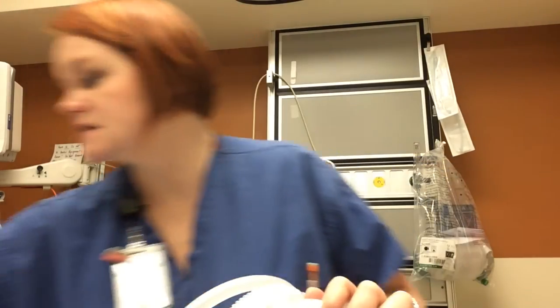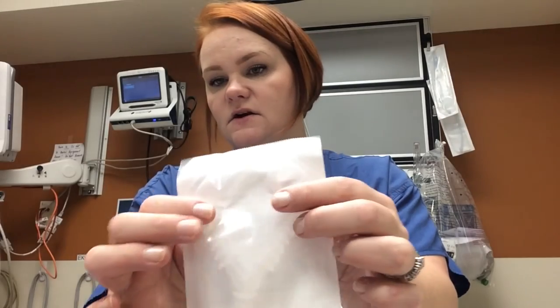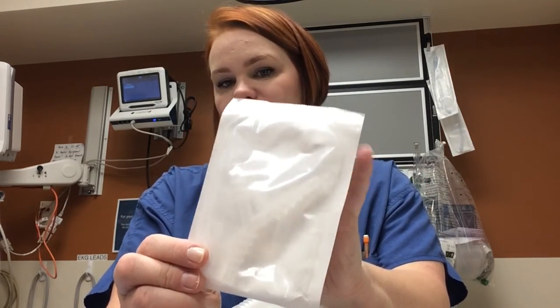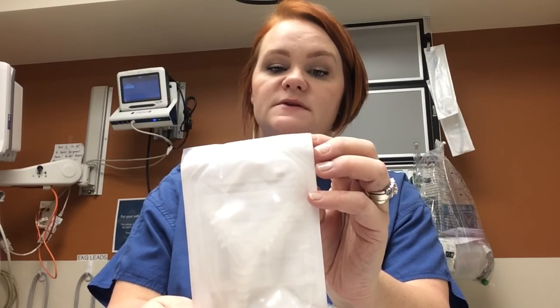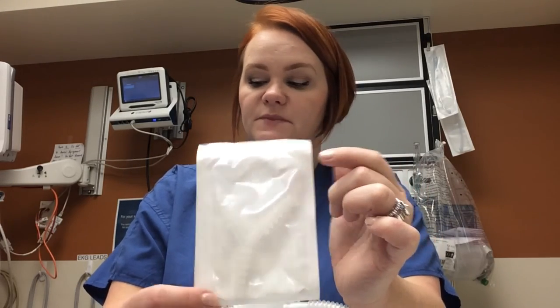If that's the case, just a little tidbit, you can also get these with Medivac tube connectors, and they're a Y-site one. So you can actually use one suction per two chest tubes. Sometimes we go running around looking for that second wall suction or the portable suction because we've already used our two wall suctions, maybe one for intubation and then one for the chest tube. We can hook this up and then go ahead and use one wall suction per two chest tubes. So just a little tidbit.